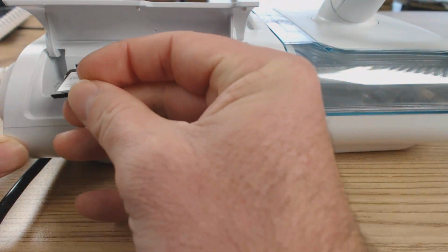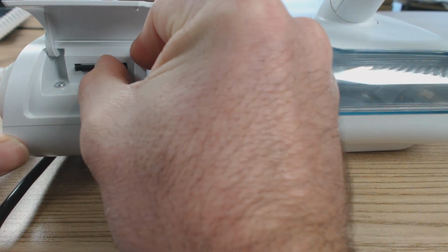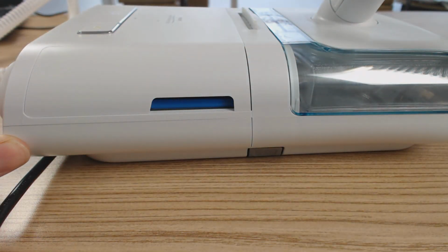All right, so that just goes in like that, and that stores all your data on it as well, if you want to export your data onto a computer or something like that. All right, but you can close that down. On the other side there is the modem, but you don't really need to worry about that too much.